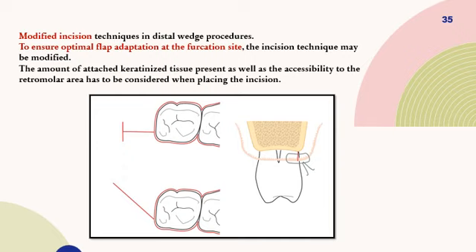The amount of attached keratinized tissue is also important and is considered when placing the incision, so that we do not remove the precious keratinized tissue from the buccal area.